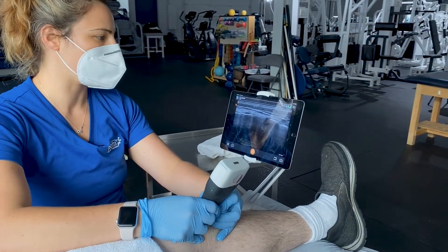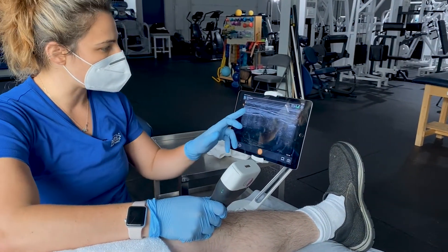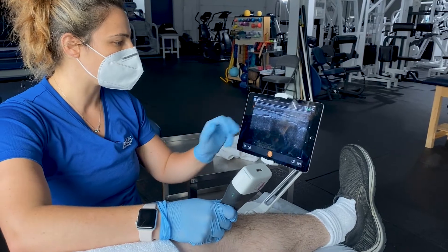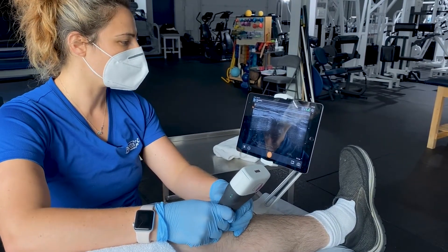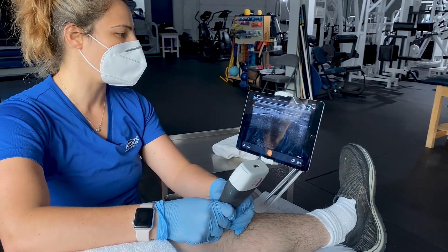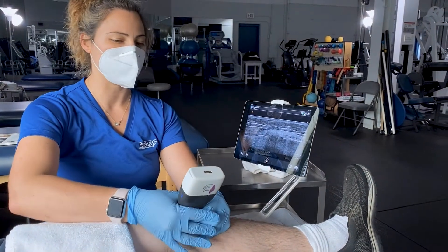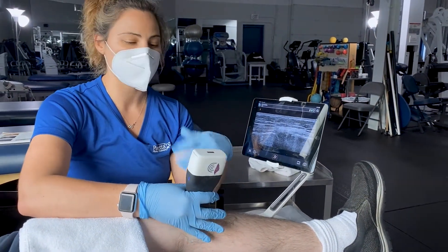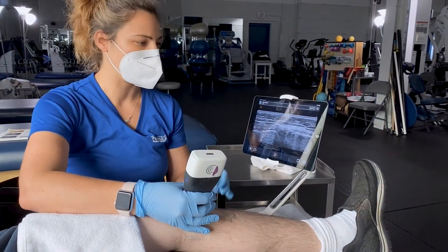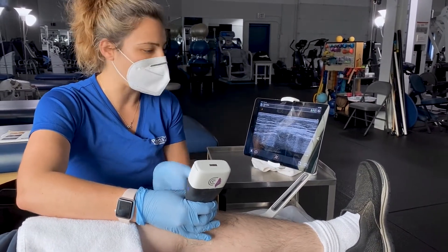We can look at it dynamically by stressing to see how the ligament across the top will respond to the stress of any pressures, torquing, or twisting forces on the knee. That's one of the coolest things I really enjoy about ultrasound — it's not just a static image. We can actually look at what happens when we put different stresses and strains on the body.